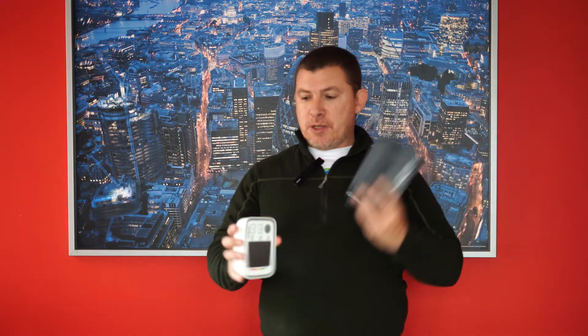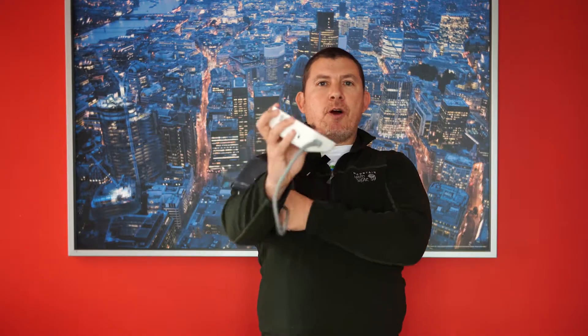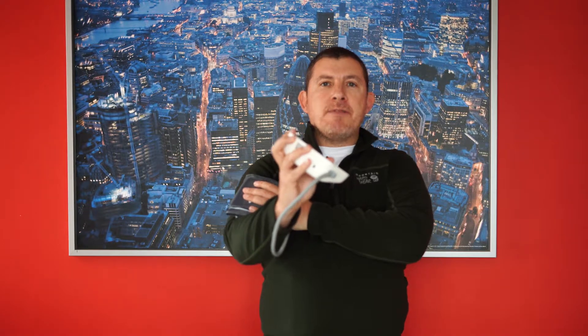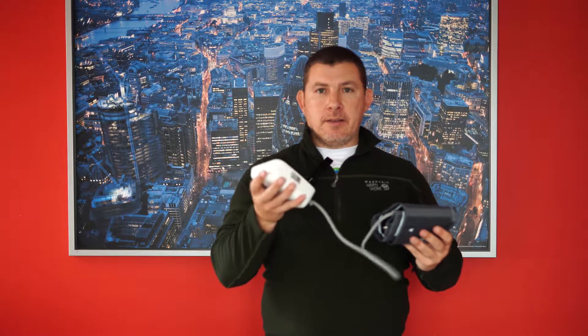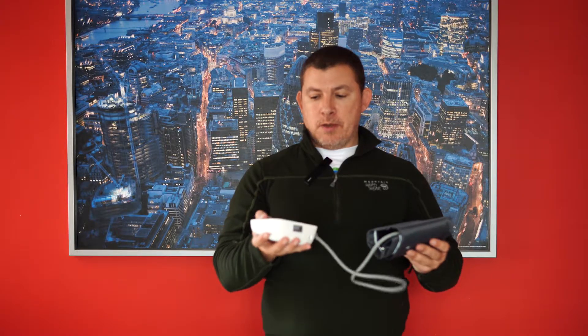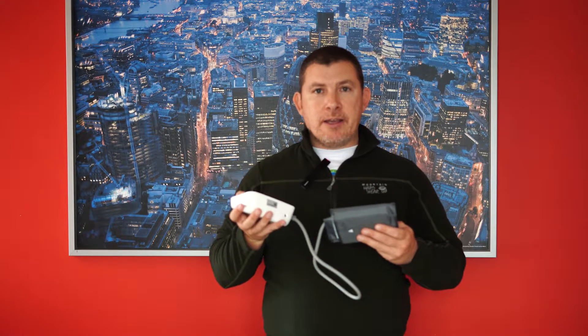In the box you get the blood pressure monitor and an adjustable cuff. So you just connect it up, put it on your arm — obviously you'd unroll your sleeve — put it on there, and then once you've done that you press the button, press start. We'll be able to hear it here although it's not connected to anything. So you can hear it there, it's going.